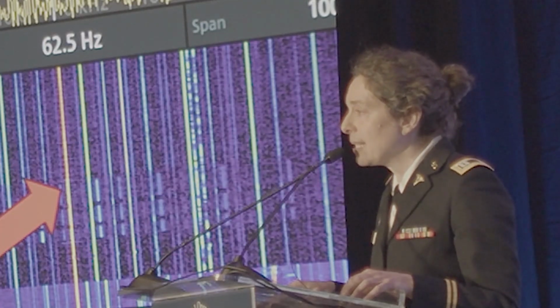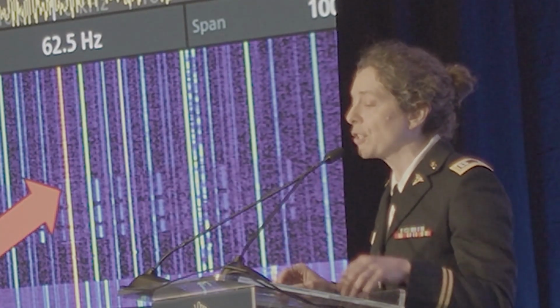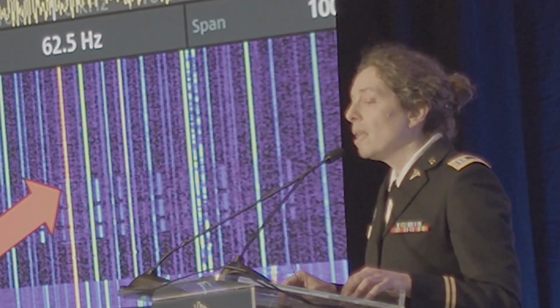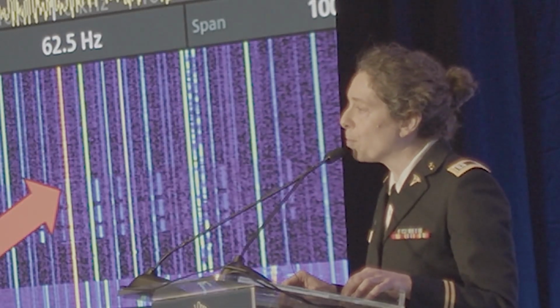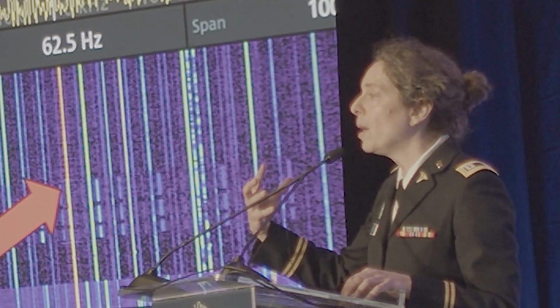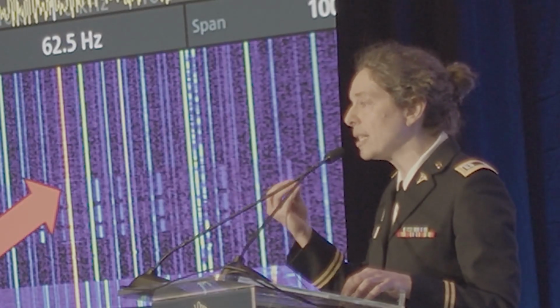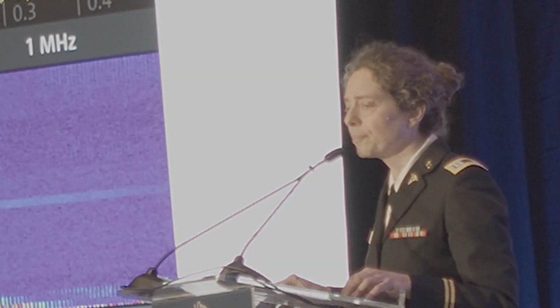You'll also notice that these Lumifies had slightly more pronounced signatures, as you can see with the red arrow in the purple field. The phased array was likely transmitting pulse wave Doppler, and the linear probe might just be a little bit less insulated, so that the radio frequency interference from the piezoelectric effect is just generating a little bit more of a pronounced signature.